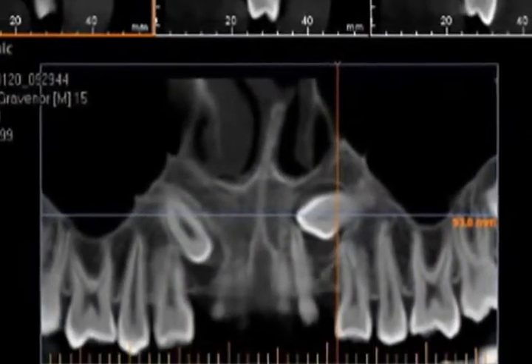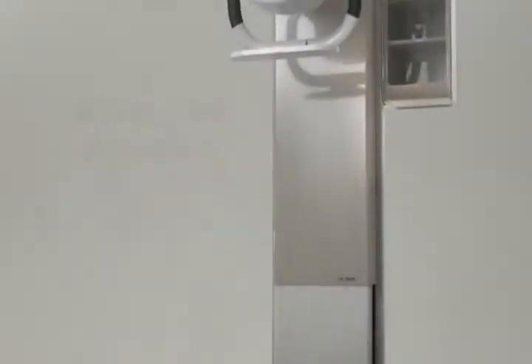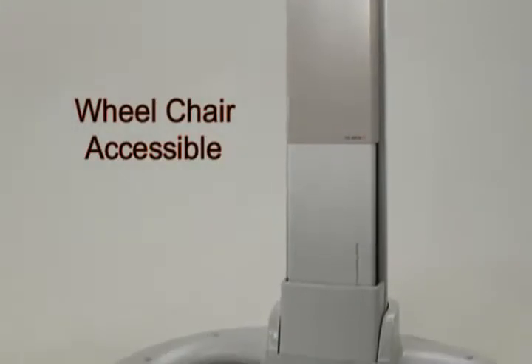Images are reconstructed in the shortest possible time by a GPU algorithm. Featuring a modern, elegant design that is wheelchair accessible, this machine will be a welcome addition to any dental practice.